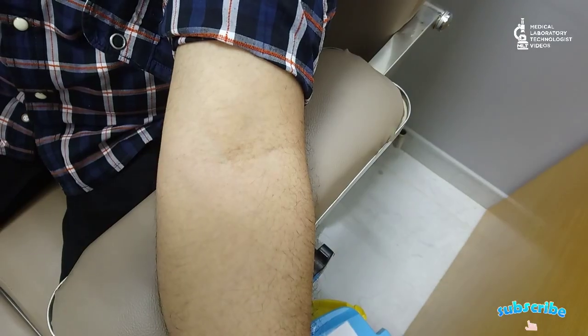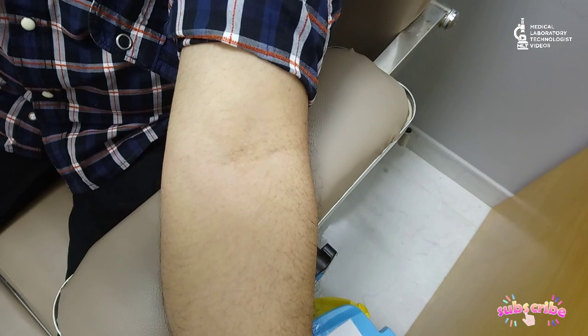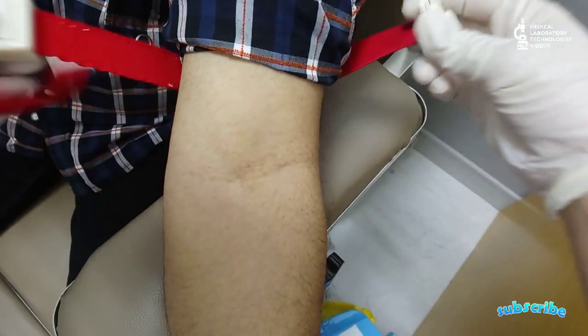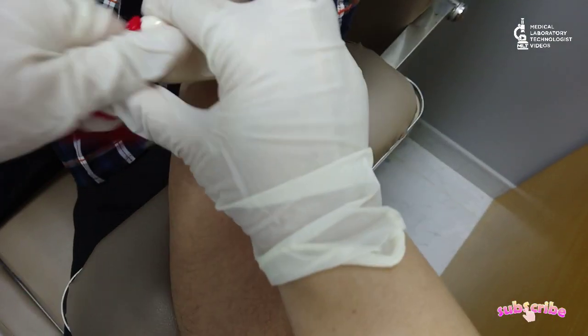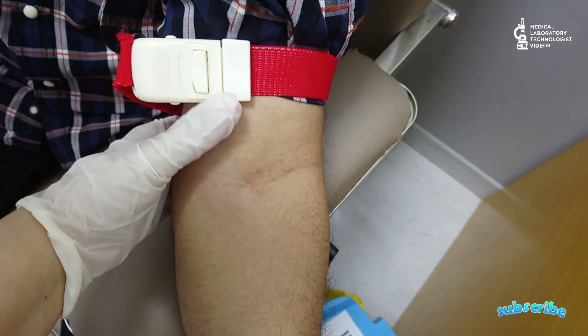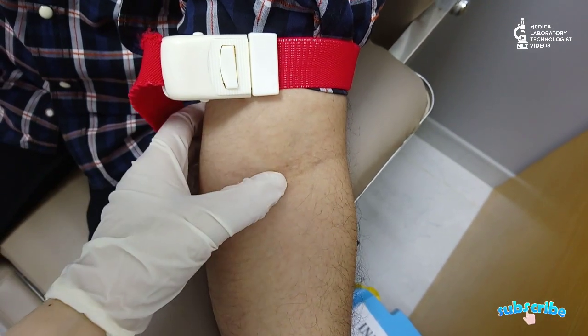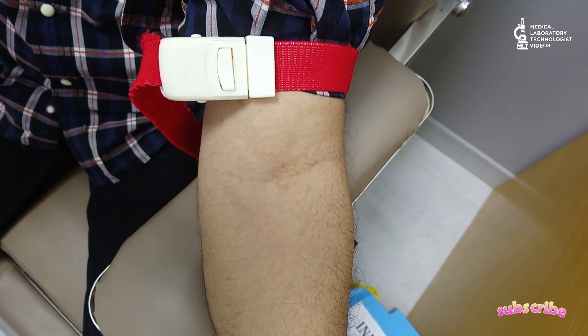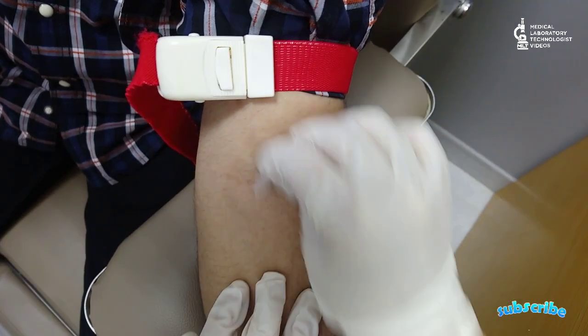Now we will start the sampling. First, tie the tourniquet tightly at the upper arm and locate the vein. Once you locate the vein, clean it with an alcohol swab or spirit, whichever is available. After that, don't touch that area — let it dry, or you can clean it with sterile cotton.